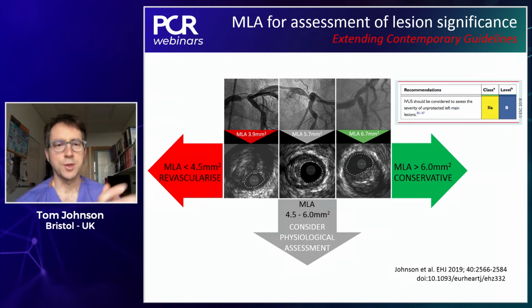And that was kind of what Cyan, I think, was alluding to: if you had a grey zone measurement on the FFR and you had a plaque looking like that on the IVUS, do you walk away? And I think that's why this is so difficult to answer, Cyan, because there is part of me that would worry about the nature of that plaque and the risk of rupture, but it is less evidence-based. There is nothing that we could really base the decision on other than a gut feeling.